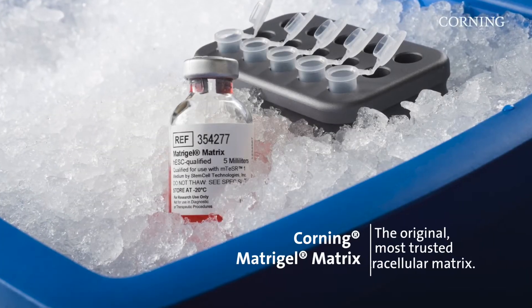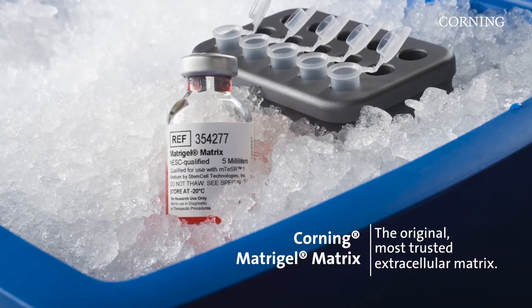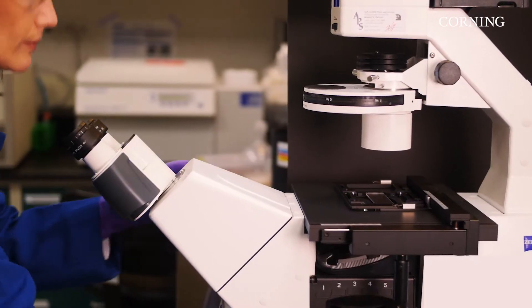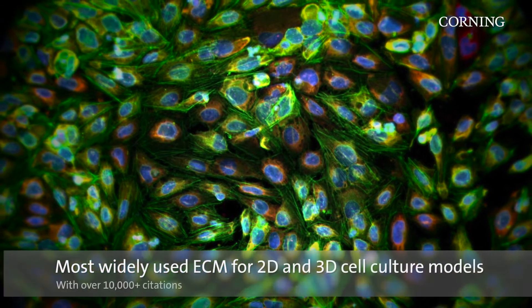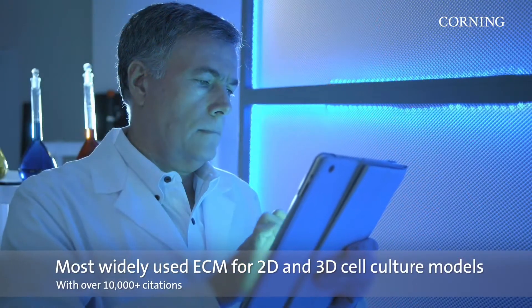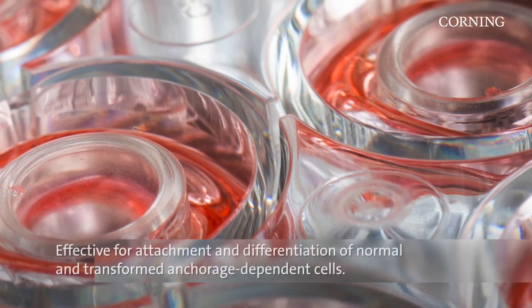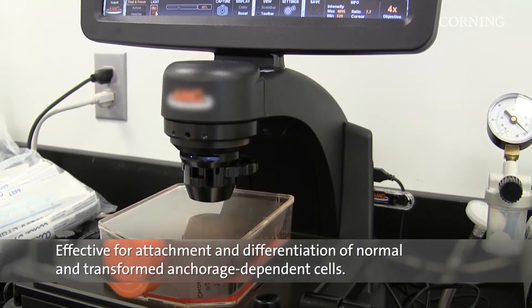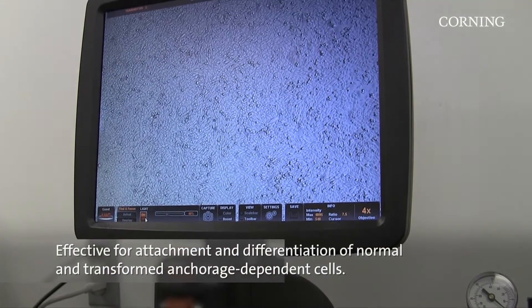For the past 30 years, Corning Matrigel Matrix has been used by researchers across the globe in essential applications through cutting-edge, life-changing research. Today, this natural ECM-based hydrogel is among the most widely used in both 2D and 3D cell culture models and recently climbed over the 10,000 citations mark. Because Corning Matrigel Matrix is a solubilized basement membrane, it is effective for the attachment and differentiation of both normal and transformed anchorage-dependent cell types.